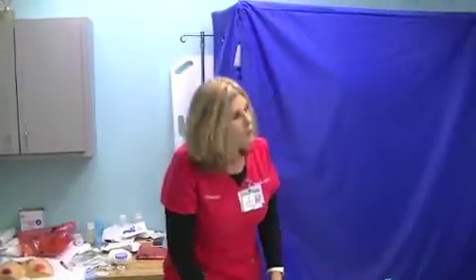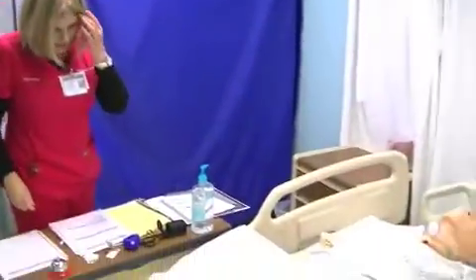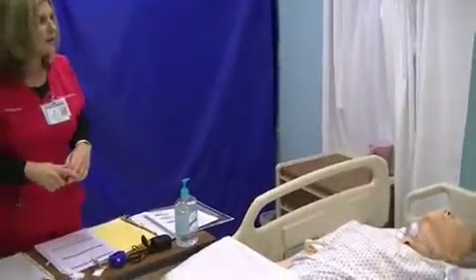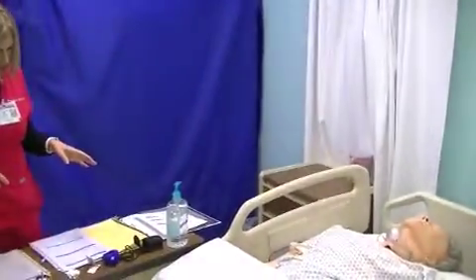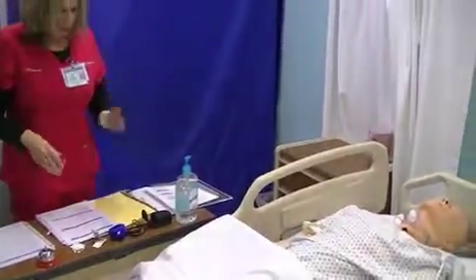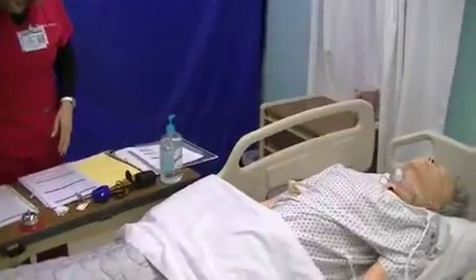Okay. Mr. Pierce, did you understand what we were doing today? Okay. And we're going to make sure we compare the results, what we got there with the pulse oximeter, to how the patient's status is. And we're going to check his status the whole time when we're doing the reading, before, during, and after.